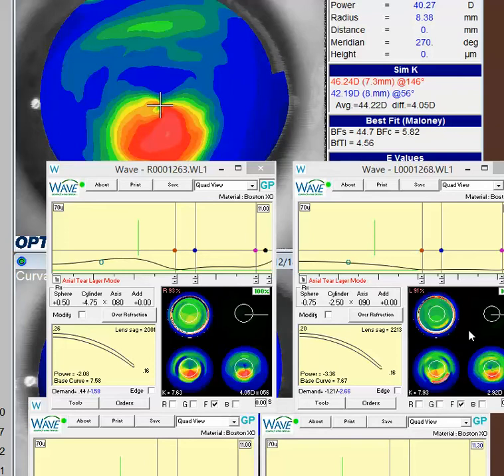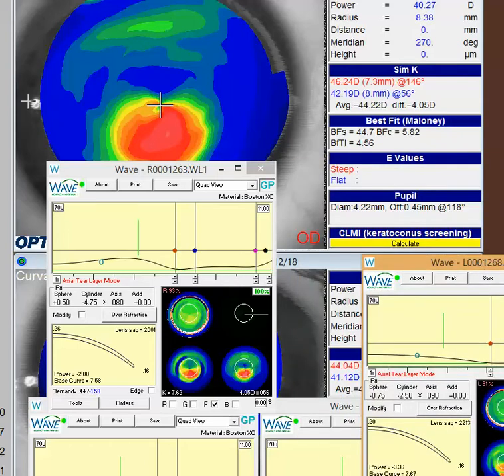From your contact lens request, or from your consultation request, it looks like you're trying to refit this keratoconus patient, and you have a couple concerns about the edge design or based on the amount of movement you're receiving, as well as a little bit on the overrefraction. So let's talk about the fit for a moment. Overall, the design actually looks pretty good.